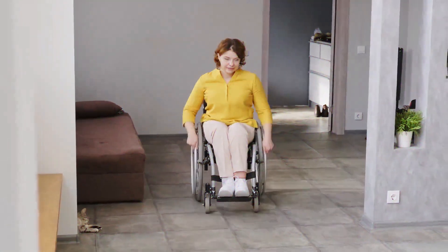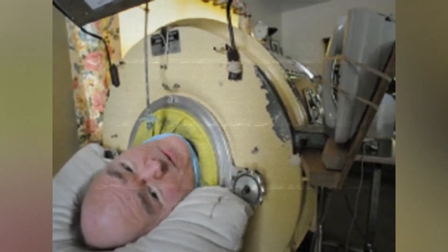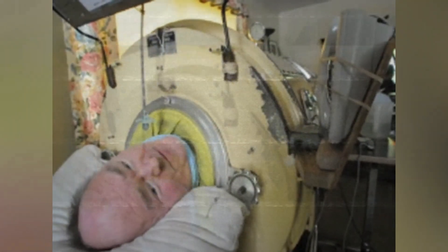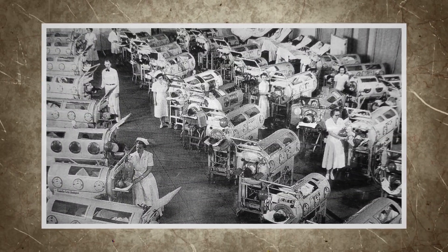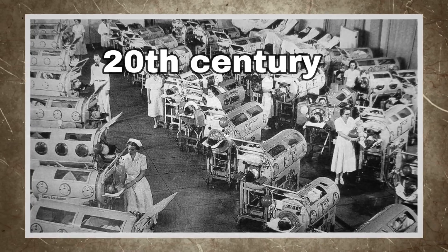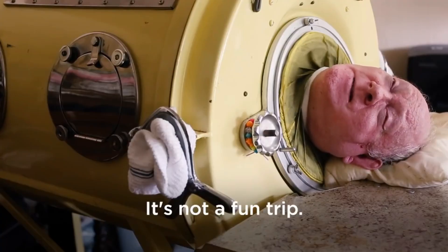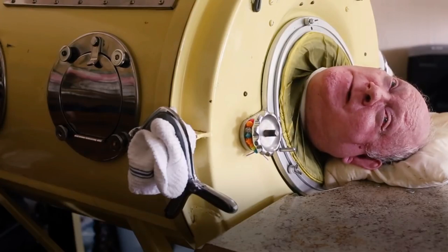Imagine being completely paralyzed, unable to breathe on your own, and facing the very real possibility of suffocating. That was the reality for thousands of people during the polio epidemics of the mid-20th century. But thanks to an incredible invention known as the iron lung, many of these patients were able to survive and even thrive.